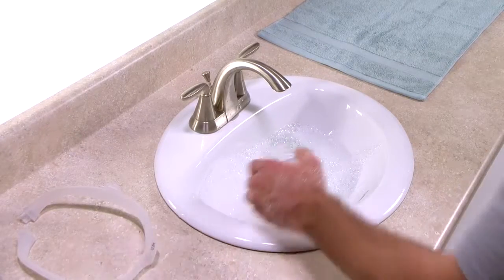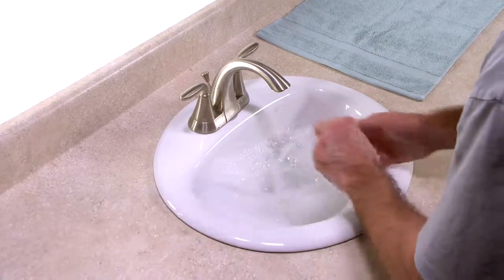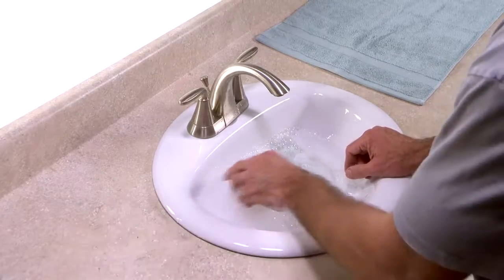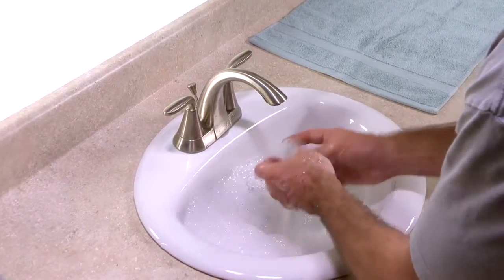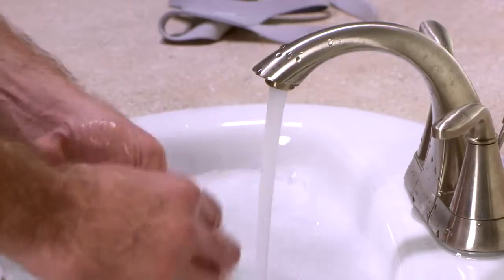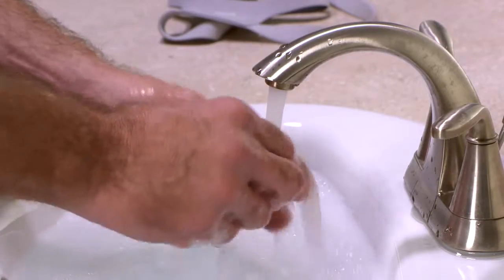Hand wash the non-fabric parts daily: the mask cushion, mask frame, elbow, and tubing quick release. Use mild liquid dishwashing detergent. Submerge the parts and examine them to make sure there are no air pockets present.